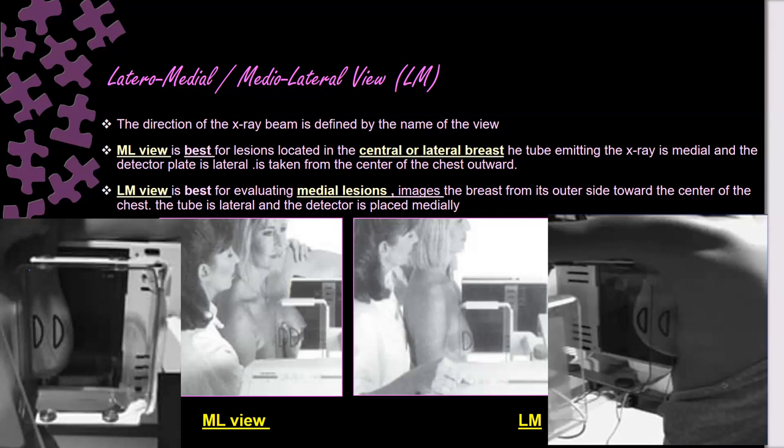What about the direction of X-ray in lateral view? These both are lateral views. When we say lateral view, it can be mediolateral, it can be lateromedial. When we say lateral, this is a lateral view. But it depends, the lateral view, mediolateral or lateromedial. If the lesion is on the medial side, we prefer the detector to be close to the lesion. The detector will be medial. That means the X-ray will come from the lateral. It will be lateromedial. Okay. And the reverse. You got it? Yes, thank you.